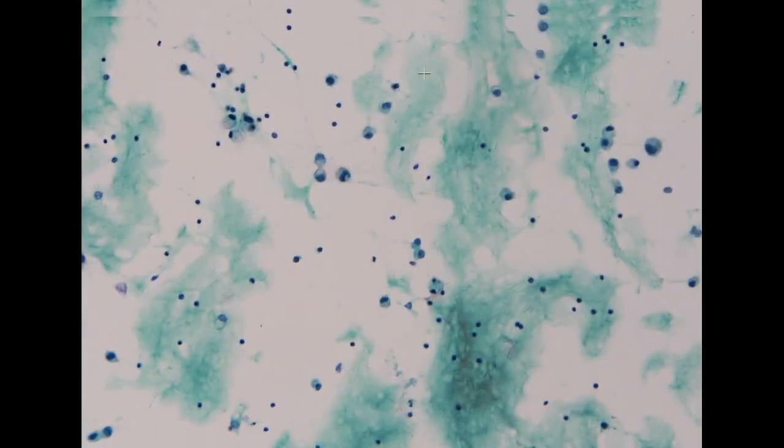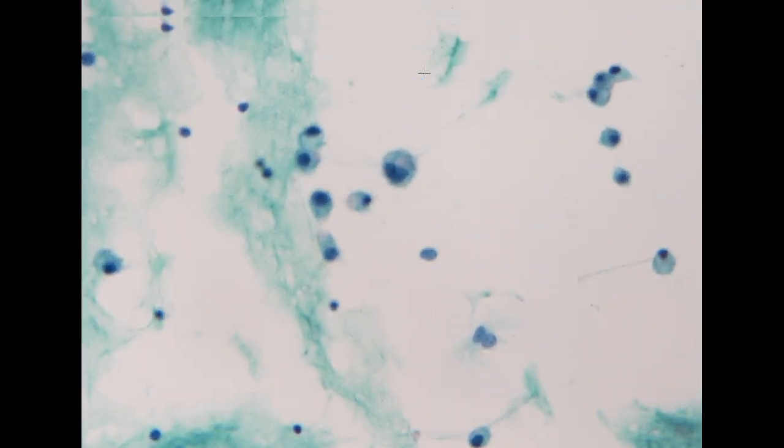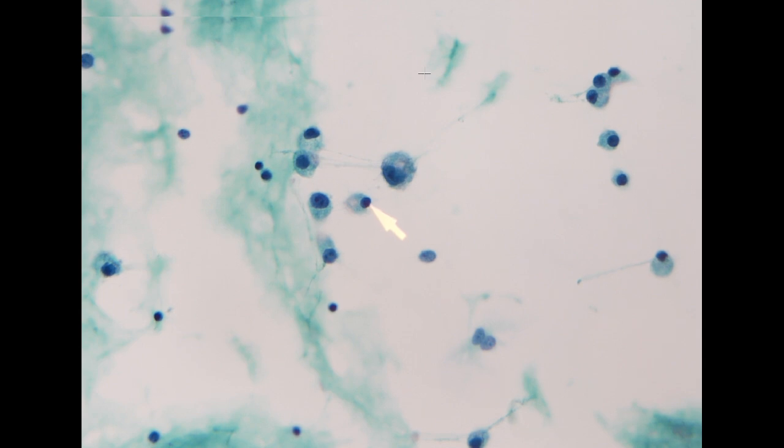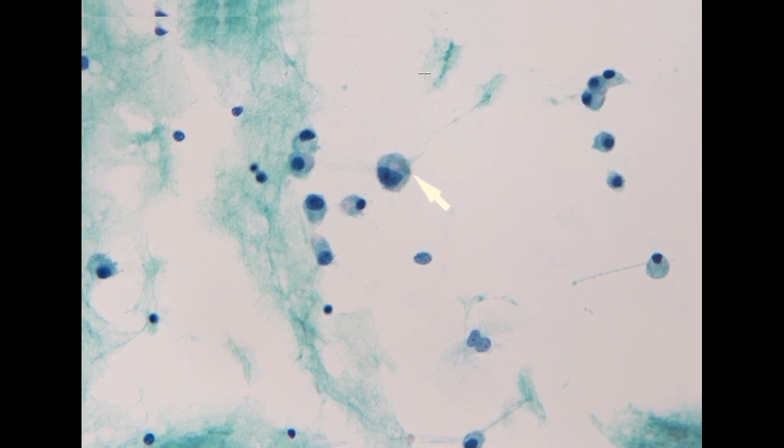Additionally, we do identify a few single cells with a relatively atypical nuclear feature. If you take a look at these cells, compared to the adjacent cells, the nuclei are triangular, along with distinct nucleoli, and the entire nucleus is eccentric. And it seems there is some material within the cytoplasm of these cells.